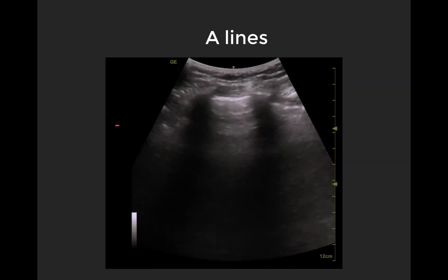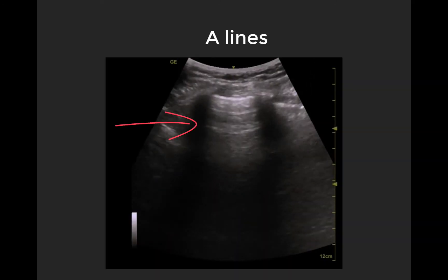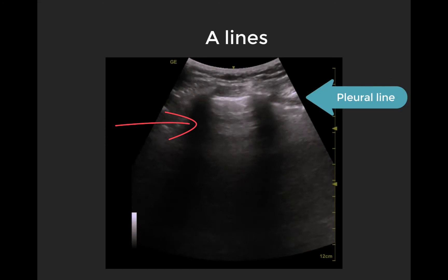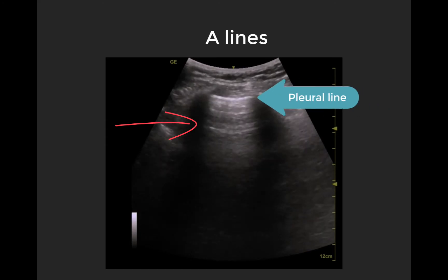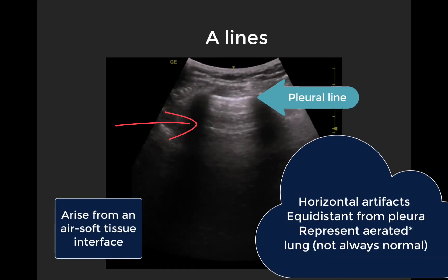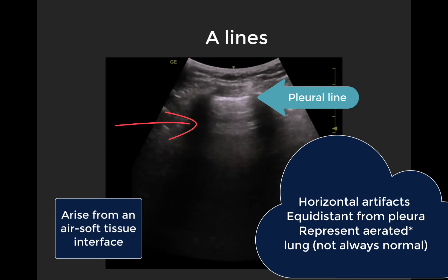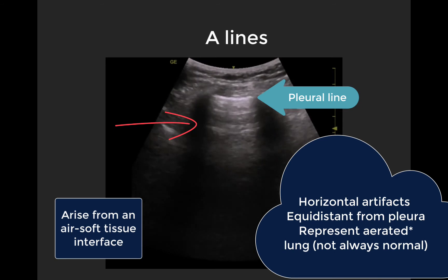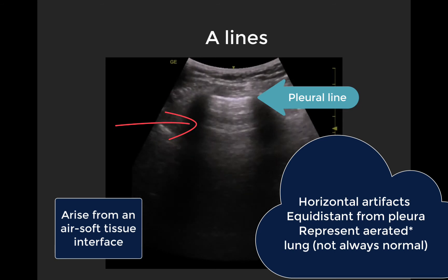A-lines are horizontal reverberation artifacts emanating from the pleural line that represent an aerated lung. That can be normal lung, but we can also see A-lines in things like COPD, asthma, or pulmonary embolism, where there is no interstitial or alveolar pathology.